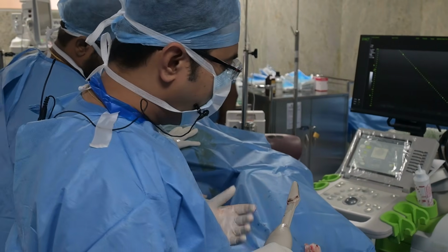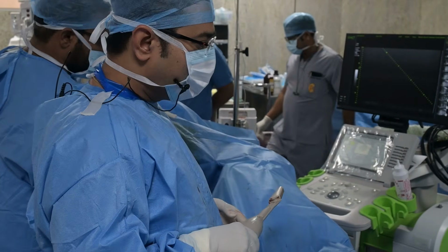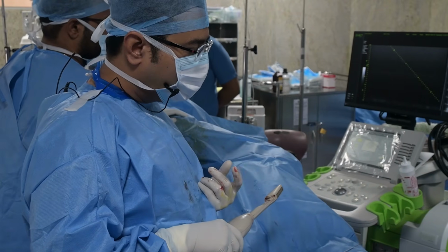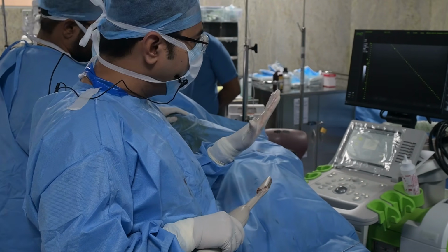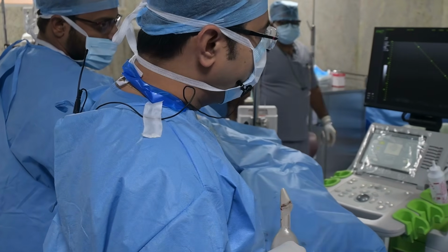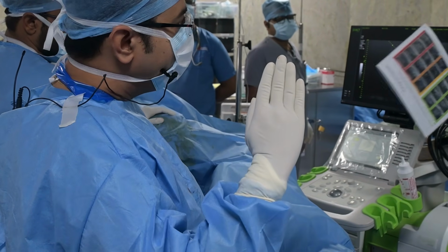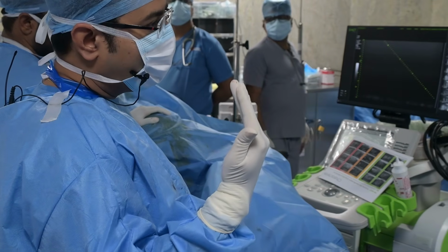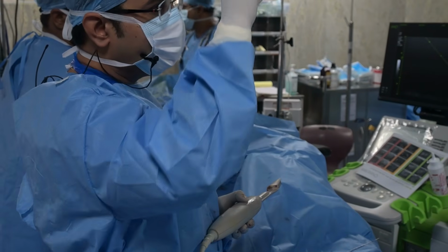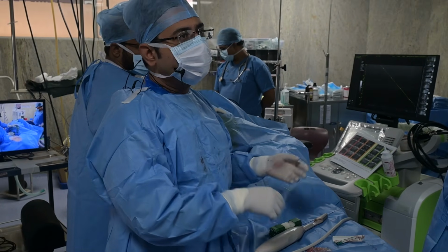So, sir, we might all be interested in a straight comparison with BK because we all use it. If I talk about the advantages, the resolution is definitely better, but it has some learning curve. You have to get used to a different kind of grayscale. You cannot get triplanar imaging in this. You don't have an end-firing approach, but your ability to target the anterior zone is very good if you go far lateral and towards the apex. If you pull your probe out, then you can see the anterior zones and also identify the lesions. I will discuss it in a while, sir.